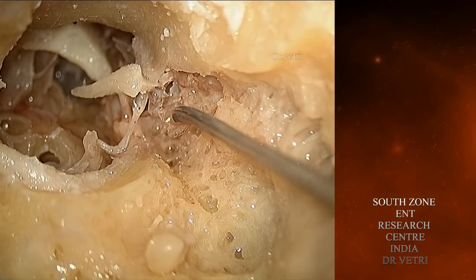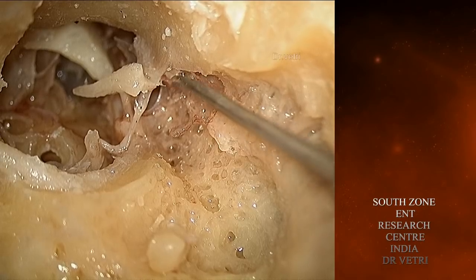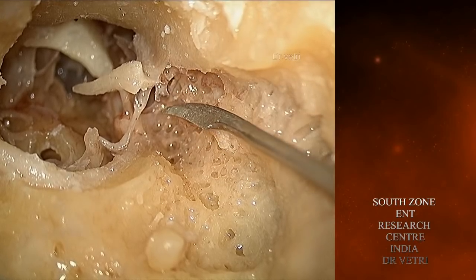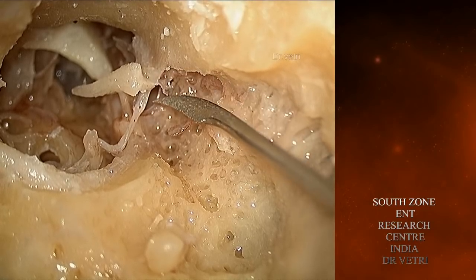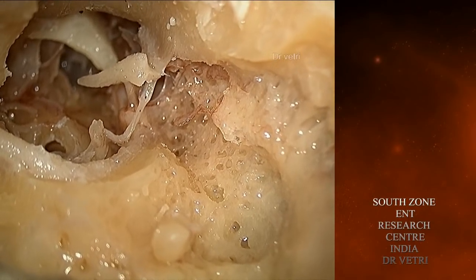So you have the relations: inferiorly you have got the horizontal portion of the facial nerve and the processus cochleariformis. Superiorly the boundary of the attic is the tegmen tympani. Medially you have got the ampullary portion of the lateral semicircular canal and the superior semicircular canal.